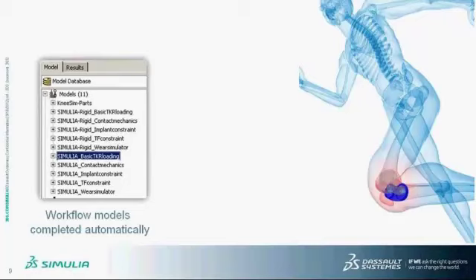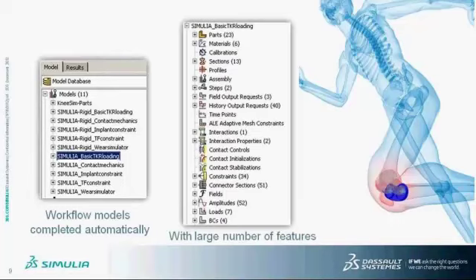What the designer will not see in the background is that these models are finalized once the workflow models are submitted. And each of these models includes a large number of features, including sections, section assignments, output requests, steps, and a large number of constraints and connectors.